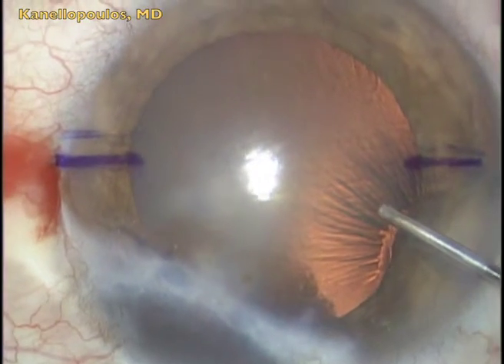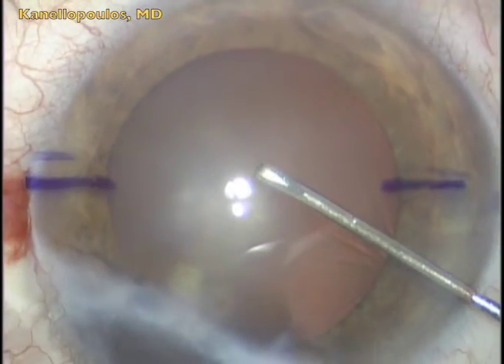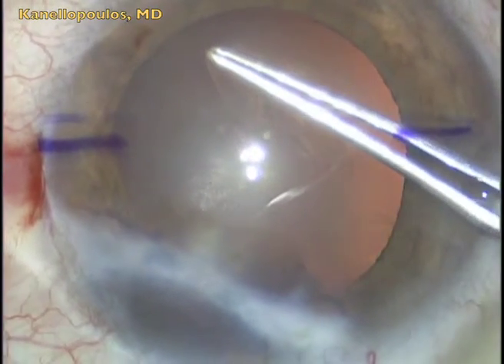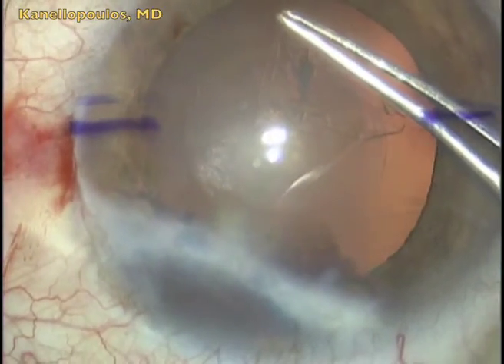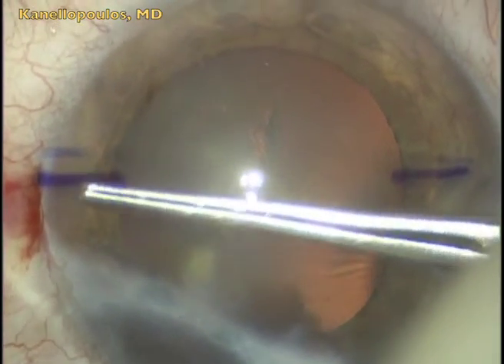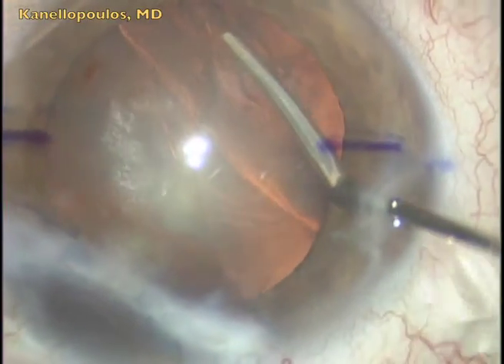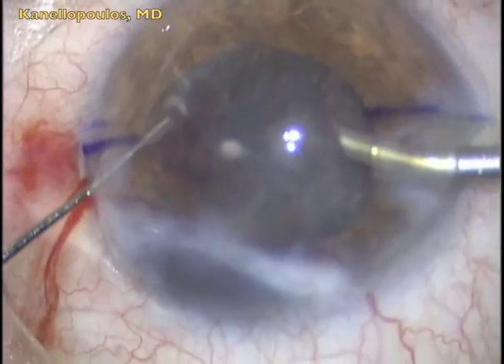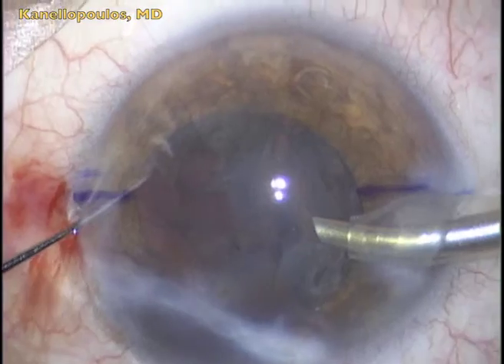Copious Viscoat here to protect the endothelium. By the way, the endothelial cell count, as you saw previously, is normal. Cystotome to begin the capsulorhexis. Visualization of the superior part of the anterior capsule is quite difficult. That's why we're going to be especially careful with our capsulorhexis forceps here to attain a capsulorhexis of about 5 millimeters with toric intraocular lenses. And specifically with the AcrySof toric lenses, I like my capsulorhexis to be a little bit smaller than my usual 6 millimeters in order to make sure that there is no movement of the lens in the capsule bag.